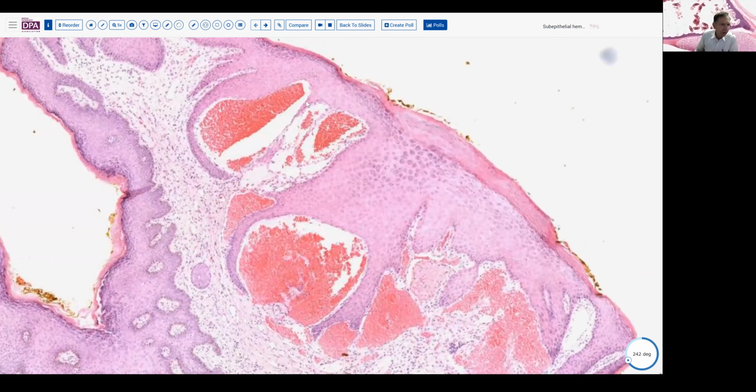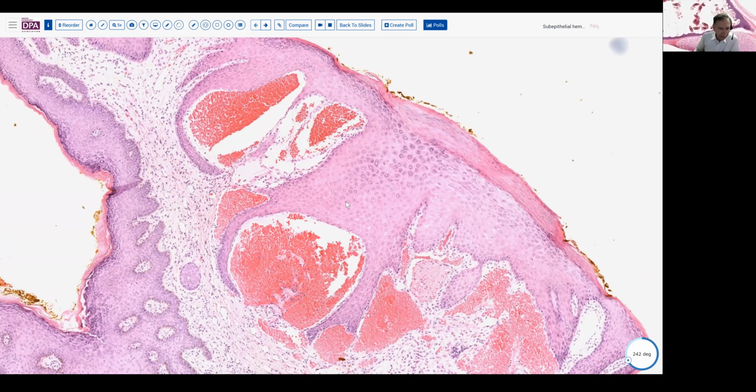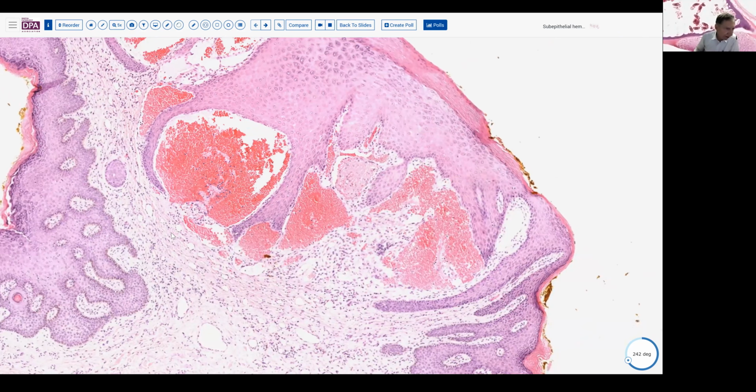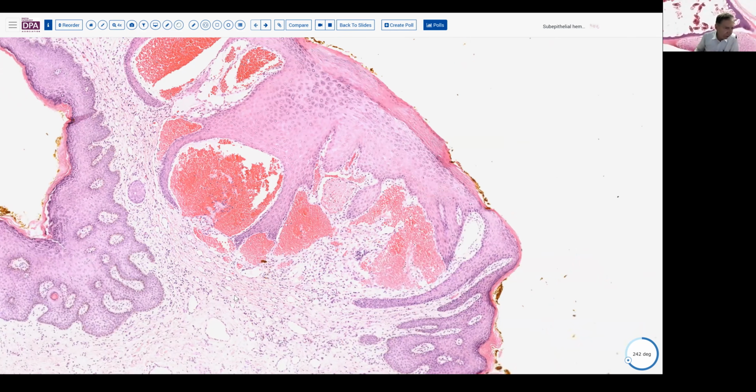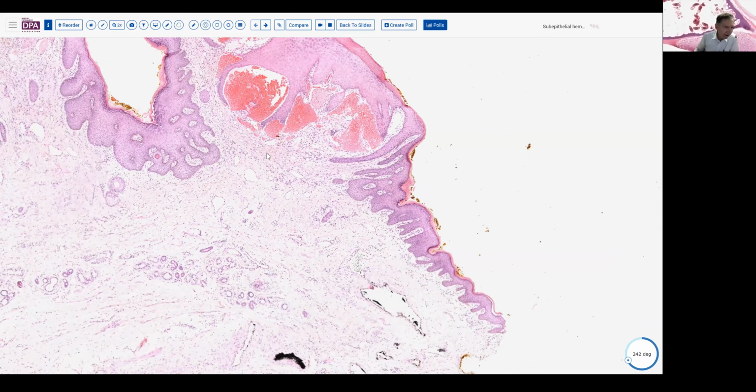immediately beneath and almost wrapped in the epidermis. So you can see here, these vessels are right adjacent to, with the endothelial cells pressed right up against the lower layer of the epidermis. And then of course there's some extravasation. You see a little bit of vascularity beneath this as well, but not too much. And notice that we don't see any larger vessels. These feeding vessels are very delicate vessels to this lesion.